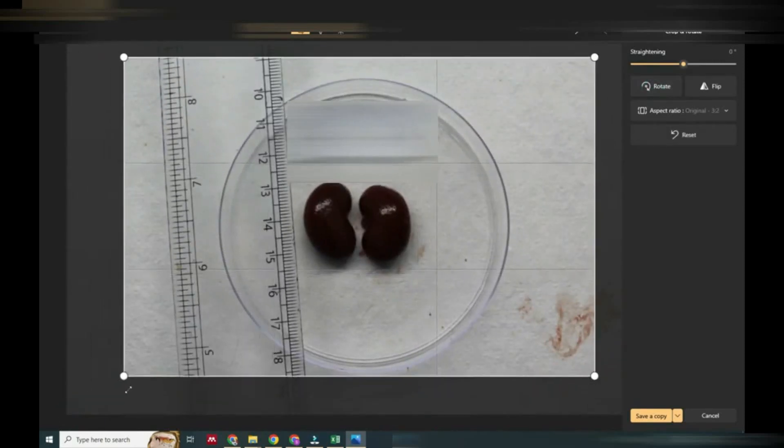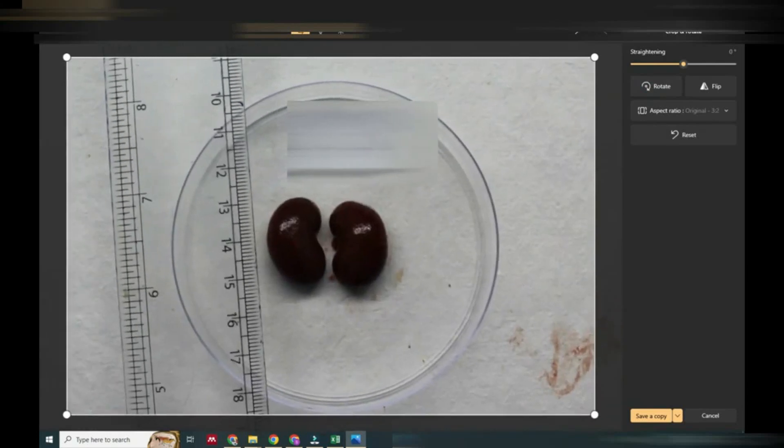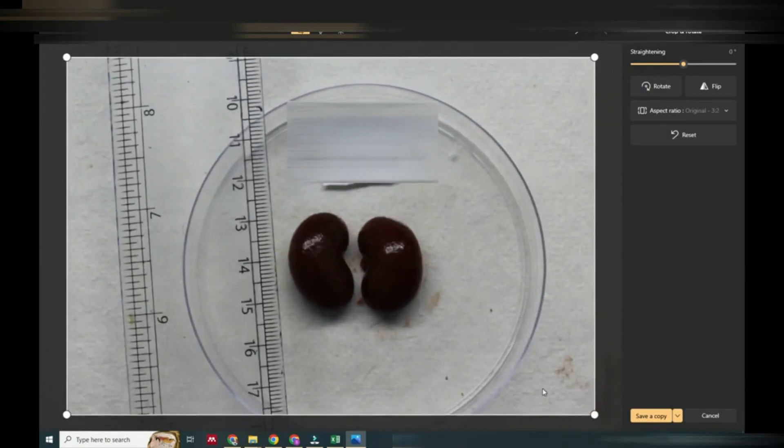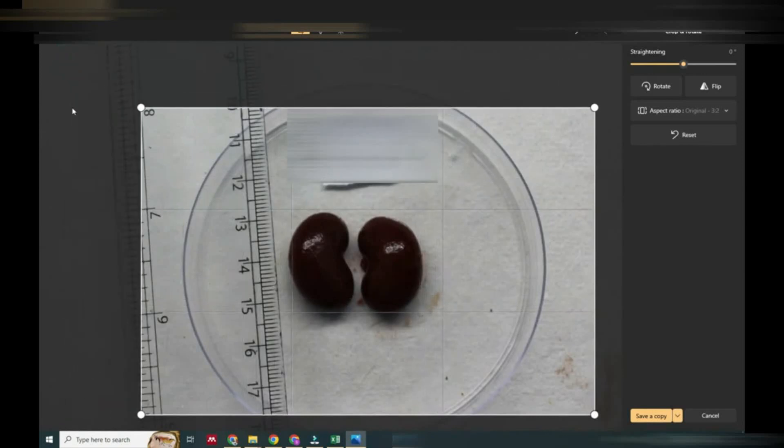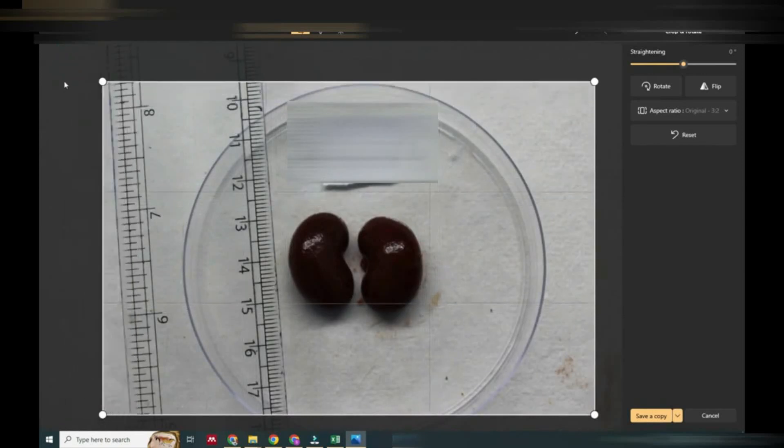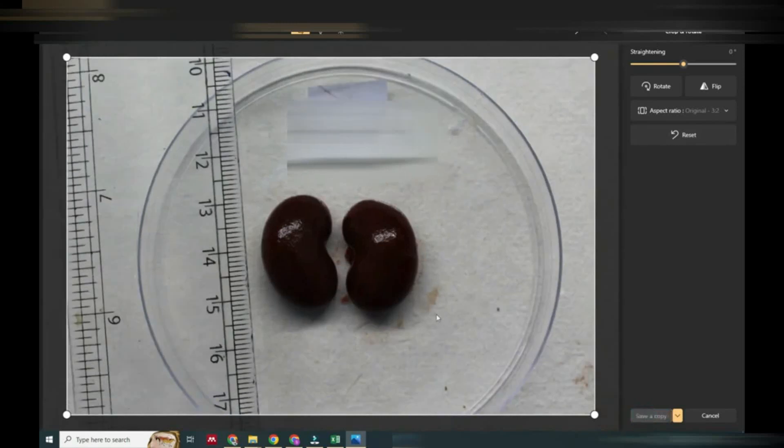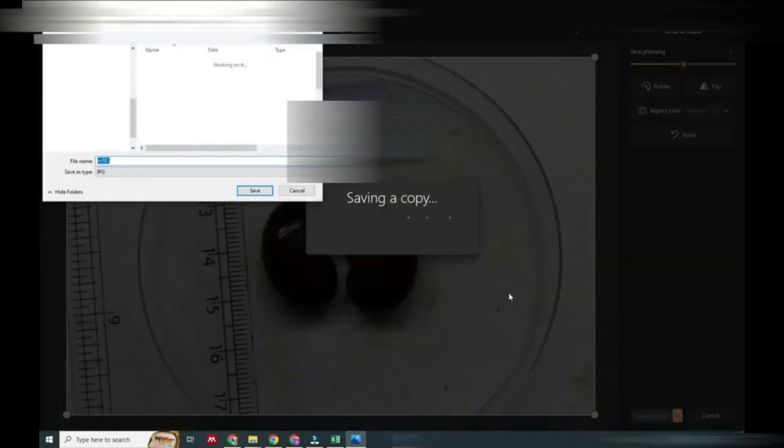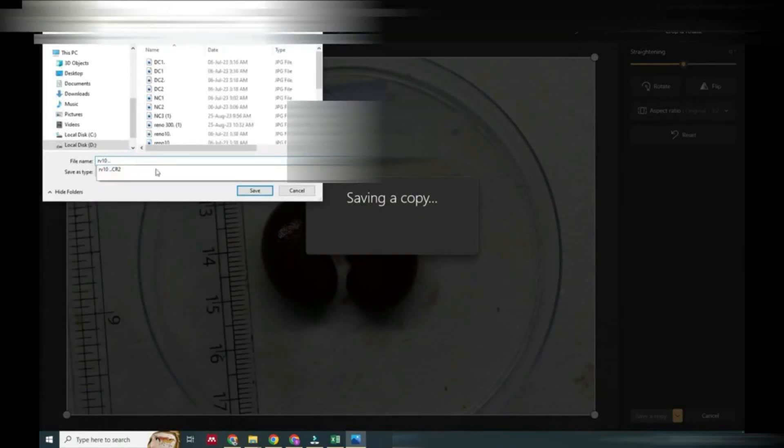Here you can see there are many tools. With those tools we can crop this image and make the picture bigger. Now we will save this image in JPG format. It is saved.